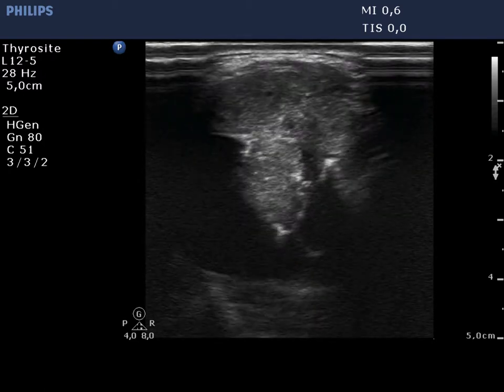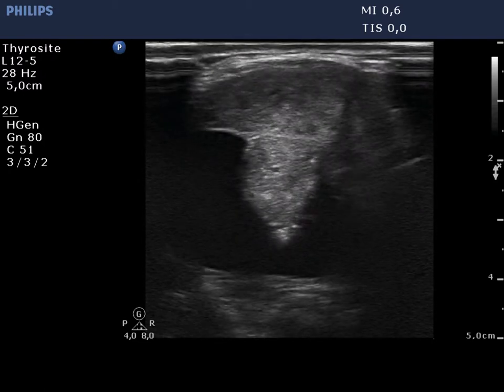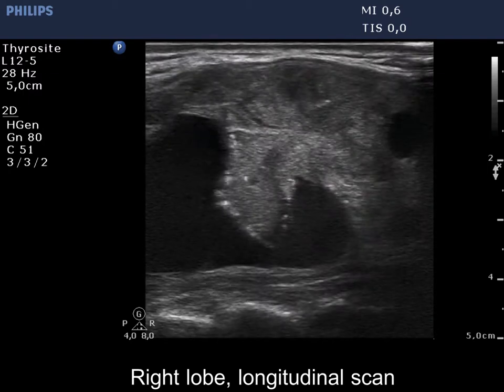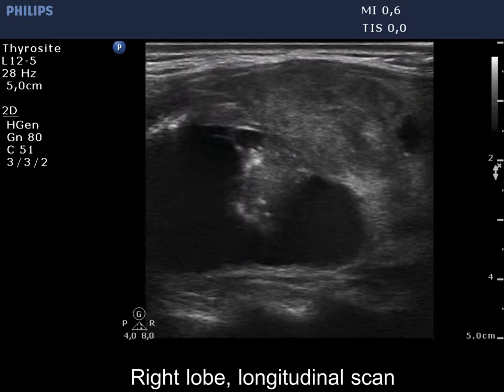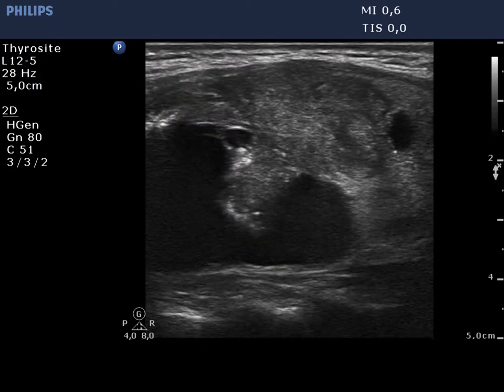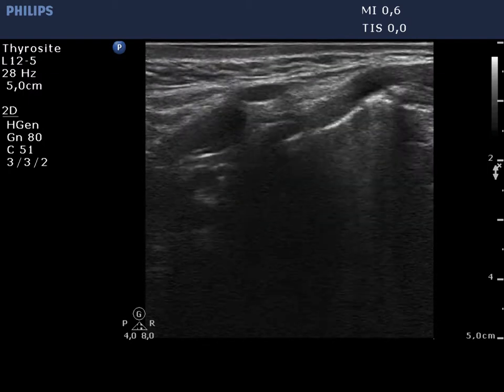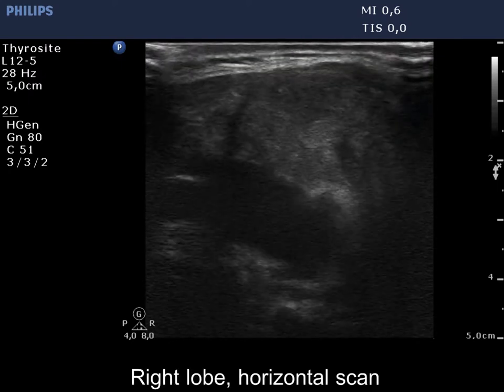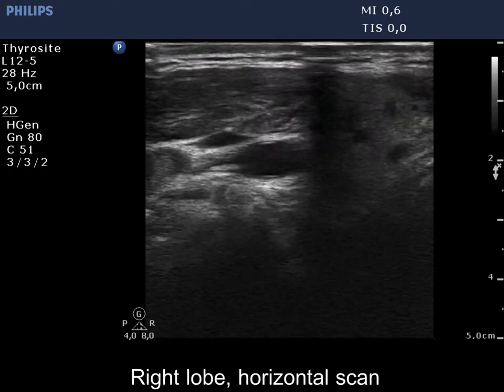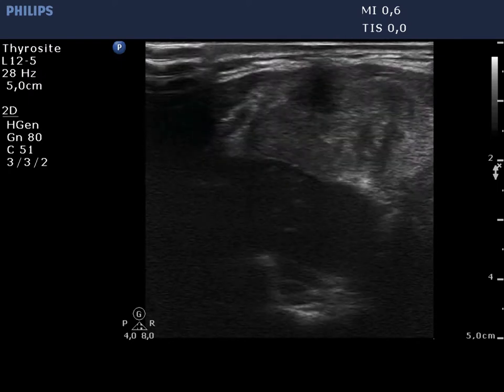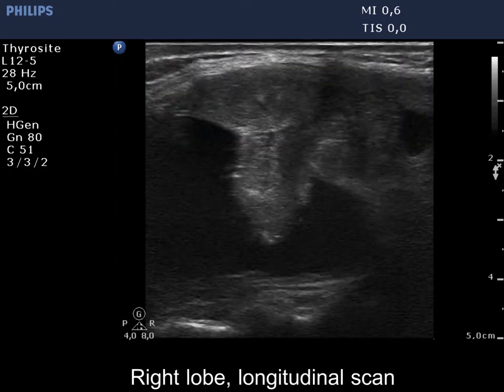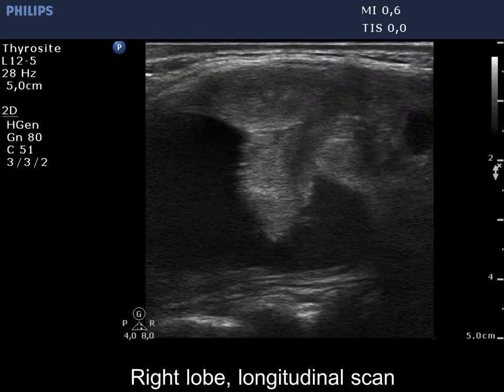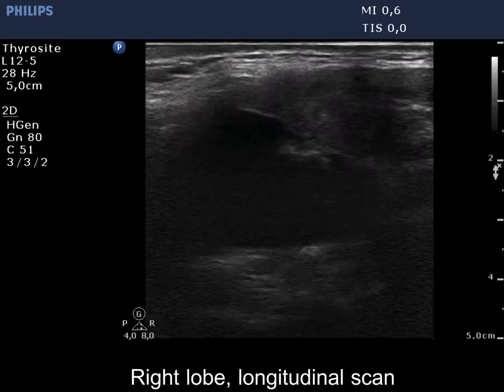The solid part is heterogeneous, dominantly isoechoic, has sharp angles, and contains microcalcifications. The lesion presents abutment which exceeds 25%, while the relevant part of the thyroid capsule is discontinuous.